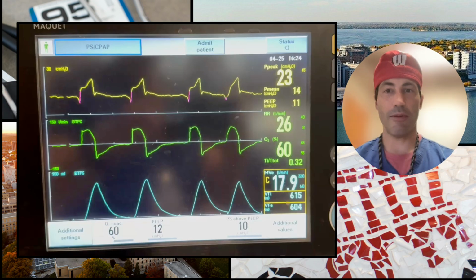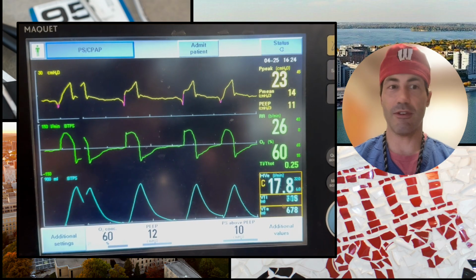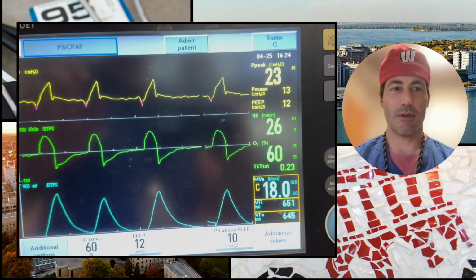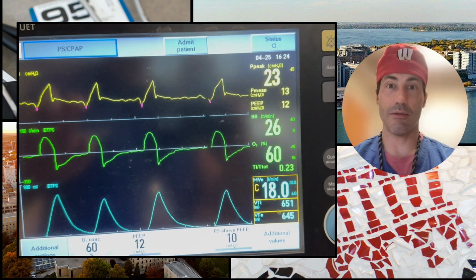Here's another example of that at the bedside. Again, pressure support ventilation doesn't look like the textbook, doesn't turn on like a square wave, and we jump off a cliff here. Occurs with pretty high frequency in our current style of ventilation, where we do small tidal volumes, so we're under supporting people, and light sedation, where they're awake and can feel it.